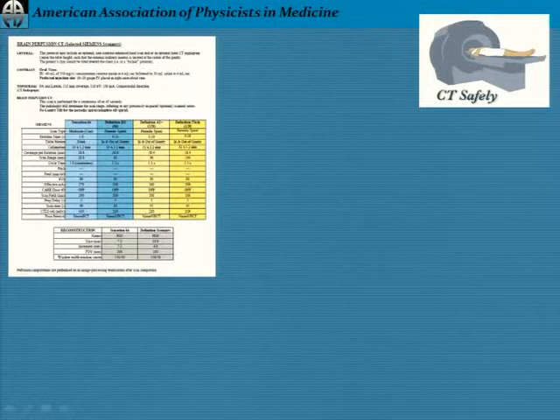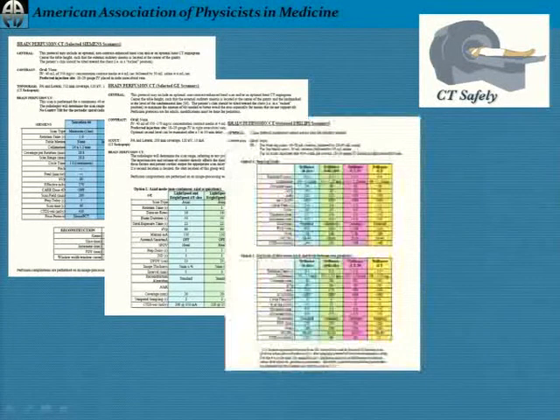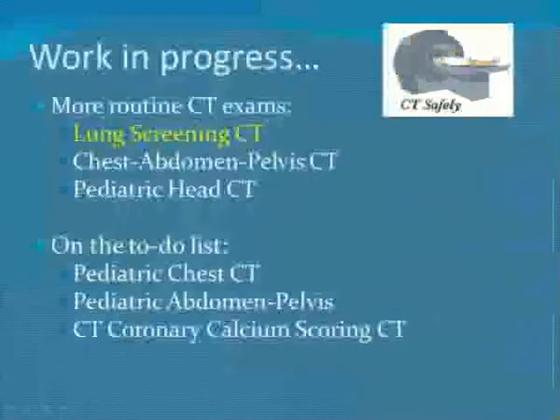But the protocol sheets are very specific to the vendor, so what you will see on them are the parameters, the terms that are actually on the interface. So you won't have to do any funky translation trying to figure out what they mean by this. They should match the interface word for word. And there is a value in each one of the slots that actually makes sense.